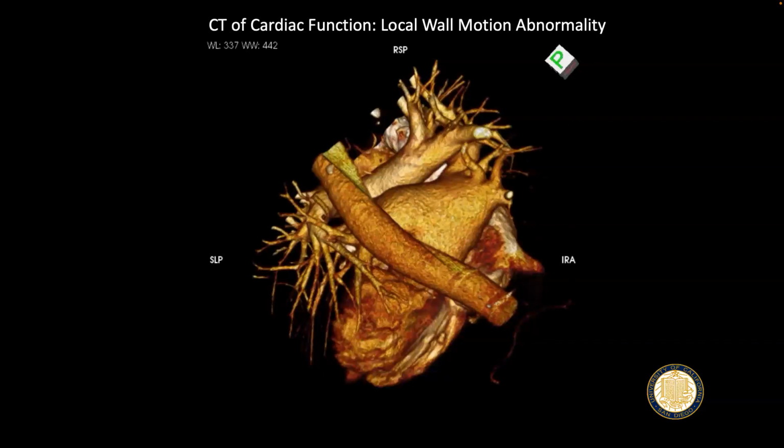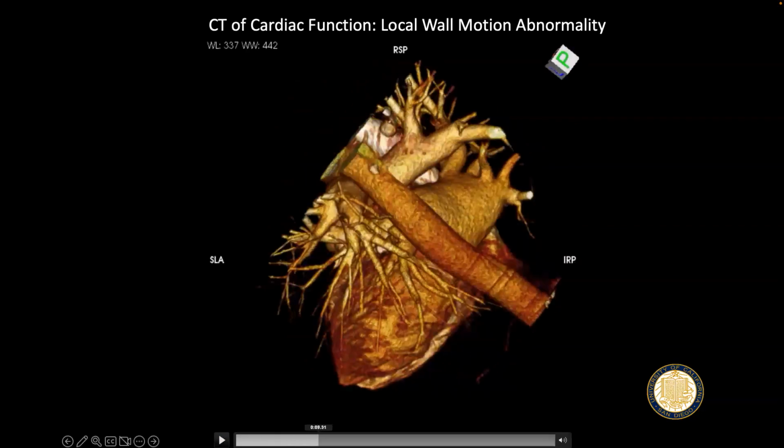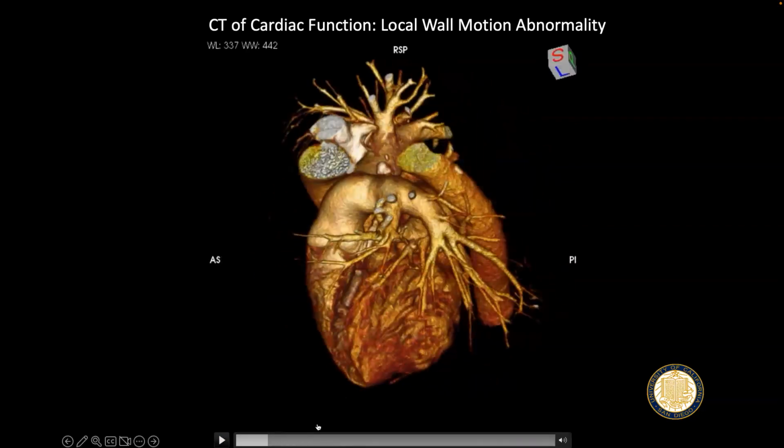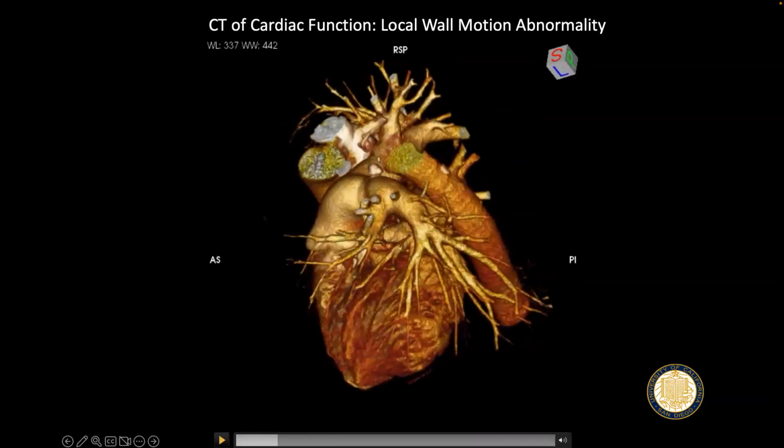And we trained, there's one of the recent papers from the lab. I really like this paper because every time I look at function, right, I look at these things and I find points here that are abnormal. This is a lot of data. This is 512 by 512 by 256, 3D data times 20 time frames. So now you've got a lot of data. Try to feed that into a deep learning network. It's hard. It's just too many pixels, right?